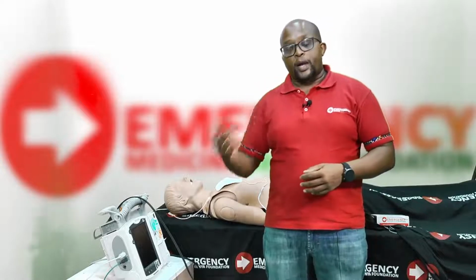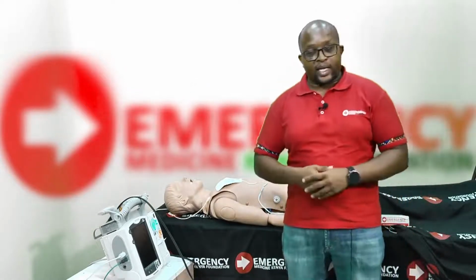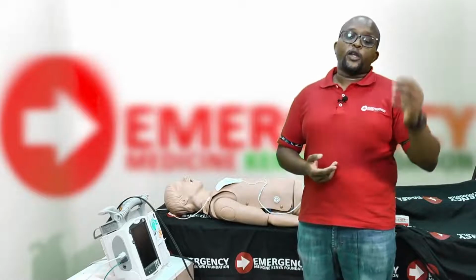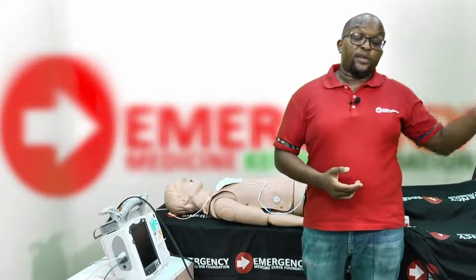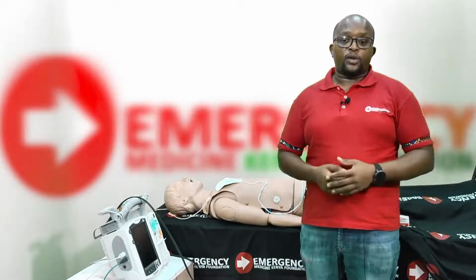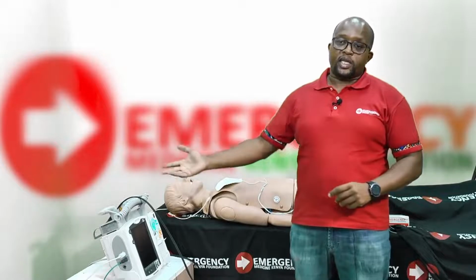So if a patient presents with a very low heart rate, below 50, and they have clinical features of shock like hypotension, shortness of breath, and altered mental status, then they are an ideal candidate for pacing. Now, with the new resuscitation guidelines, you have two options: either give drugs like adrenaline or inotropic and chronotropic drugs that would augment the patient's heart rate, or you can use a pacing machine, which is usually a function that's part of your defibrillator.